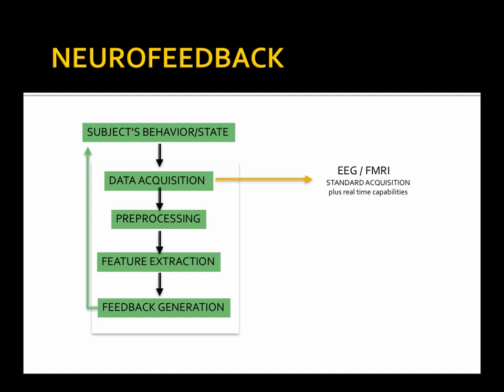In the GE scanners, we have integrated AFNI in real time, and if you're scanning on the GEs, you will see the time courses pop up on the screen, and that data can be taken and put into the rest of the special programs that would allow you to process and display it back to the subject.